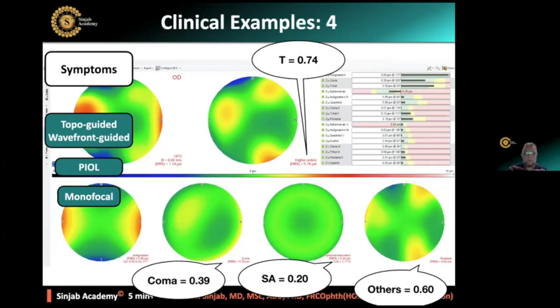It is just monofocal. And by the way, when the patient is suffering from higher order aberrations, it's better to put the monofocal with spherical aberration 0, which means that we do not complicate his eye. We do not add or deduct spherical aberration, all right? We just keep his high order aberrations as they are when we implant a monofocal with spherical aberration 0.